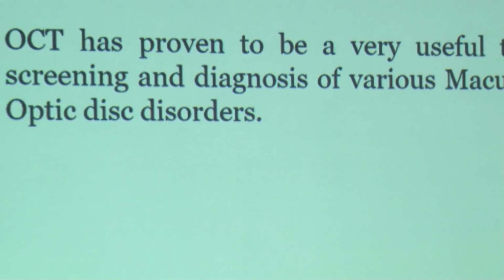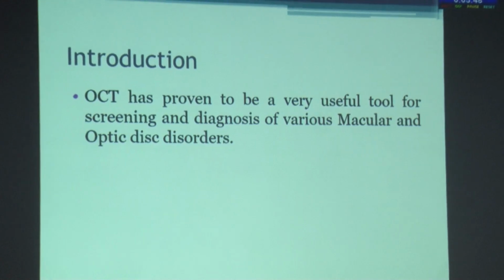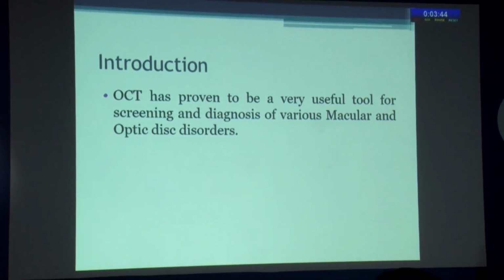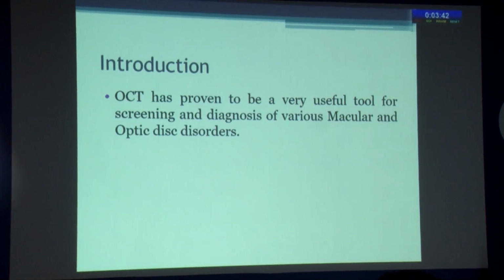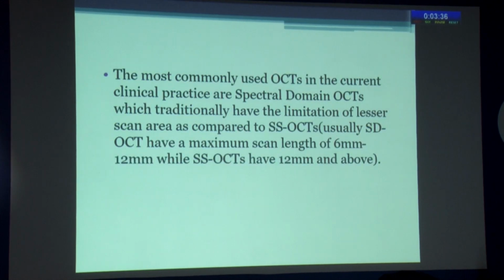We know that OCT is now a day-to-day tool for most practitioners. Even a single practitioner in a private OPD has an OCT installed. It's like a slit lamp for us now. We use it for screening of various retinal and macular disorders like optic disc edemas, glaucomas, macular edemas, etc. The most commonly used OCTs are the spectral domain OCTs, but the newer ones are SS-OCTs.